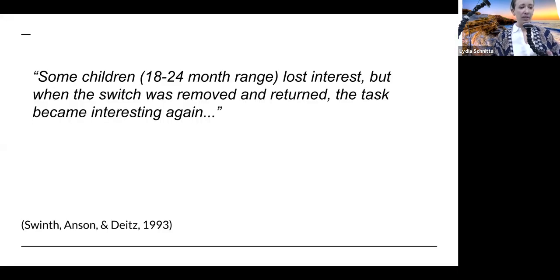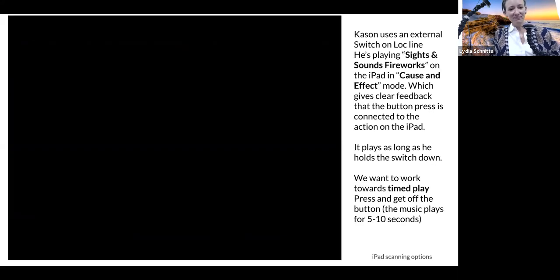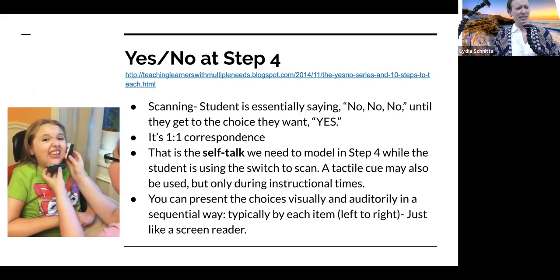In one of the studies I cited, they found even little kids, babies, toddlers, lost interest, but they liked it later. So just remove the switch, bring it back later, and the task can become interesting again. So that was the one I wanted to follow up with.